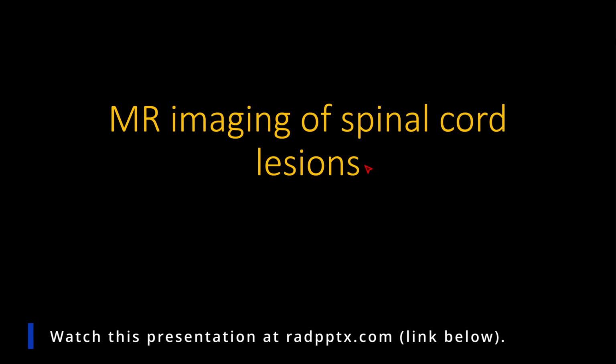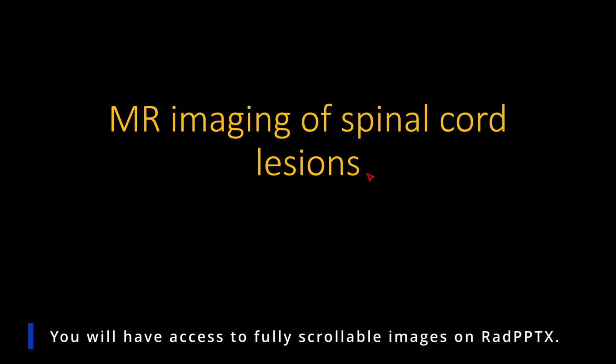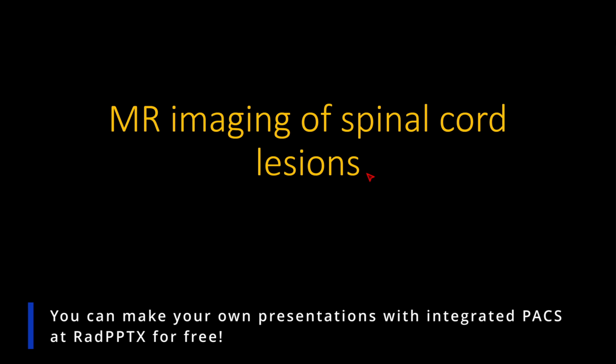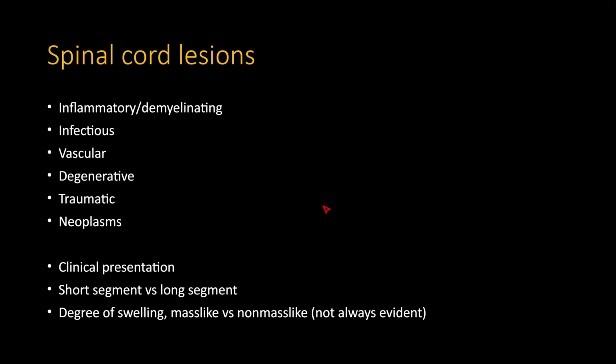In this presentation, I'll be talking about MR imaging of spinal cord lesion. This presentation is actually naturally meant to follow the white matter diseases presentation. So if you haven't watched that one first, I recommend that you watch that one first and then watch this presentation.